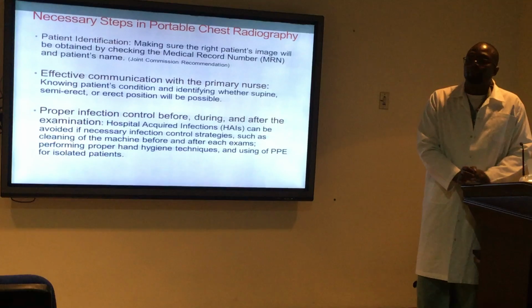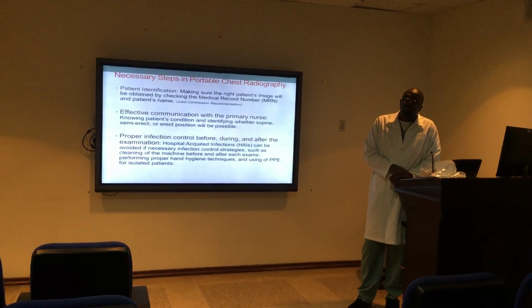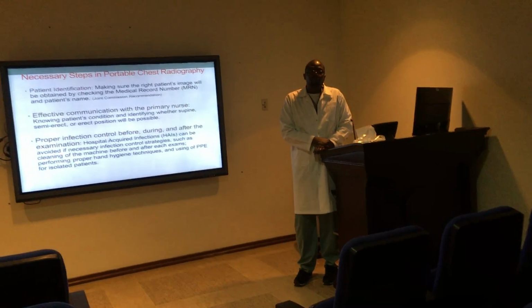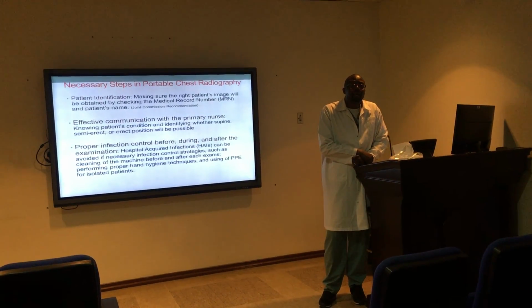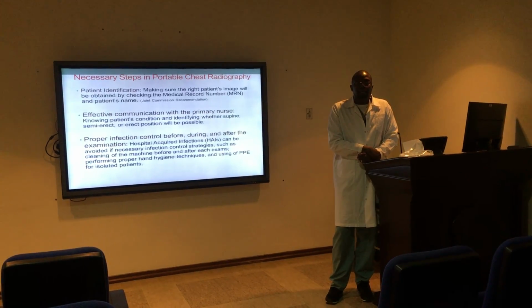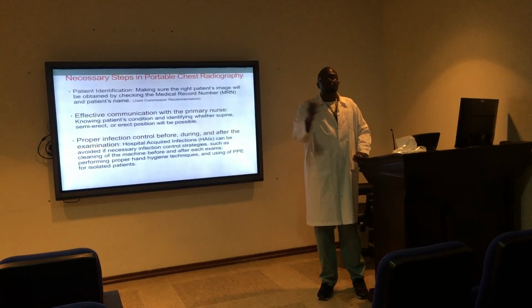Infection control. As we all know, there is a great deal attached to proper infection control, especially with mobile machines. In our case, our machine is being moved from one patient's room to another.